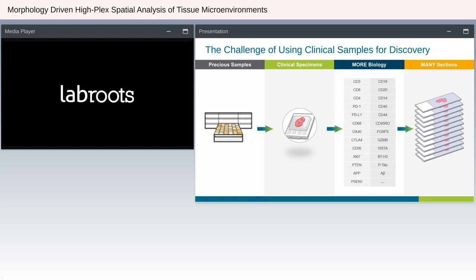So ideally, a perfect technology for predictive biomarker work, especially in reverse translation where we've got banked tissue samples, would be to get all of this multiplex data, but get all of it from a single tissue section where we can get all of that combinatorial information together from a single slide.